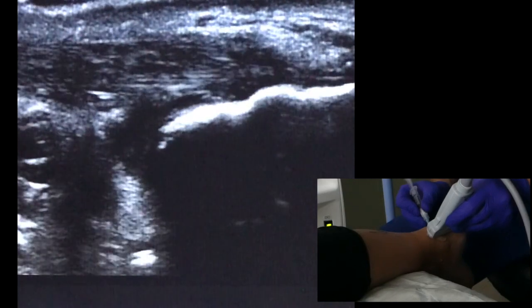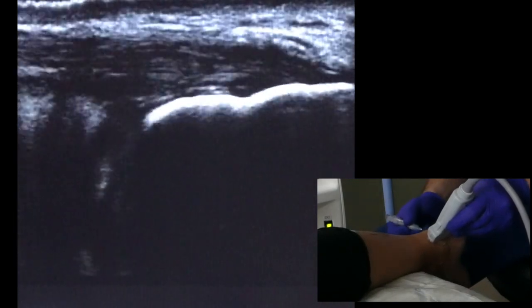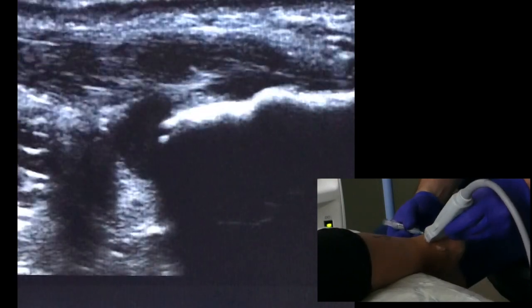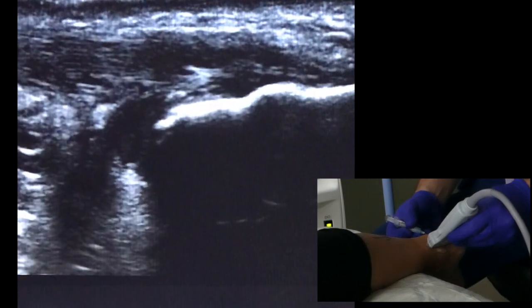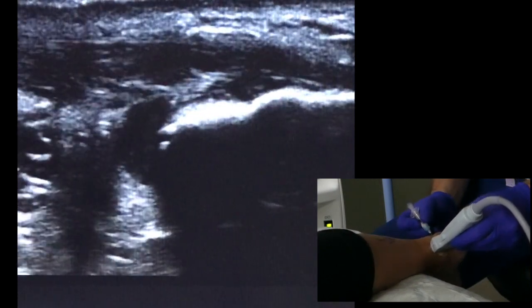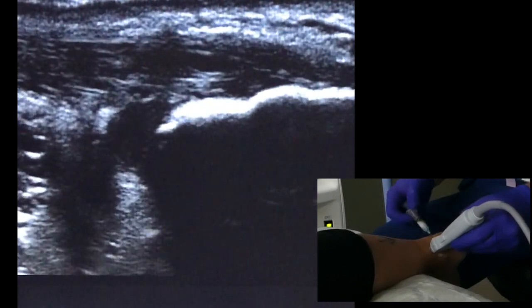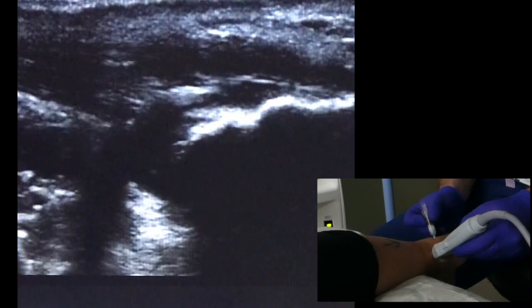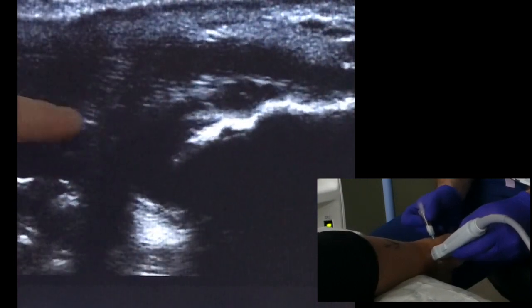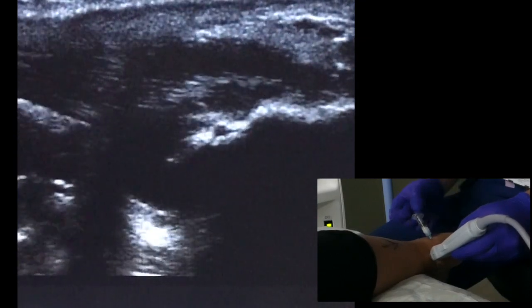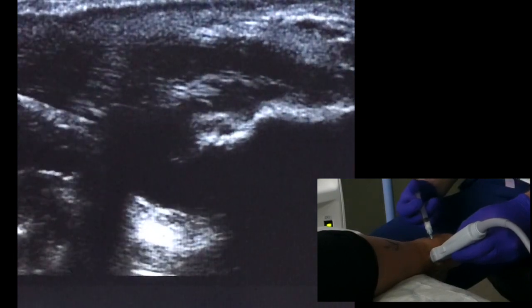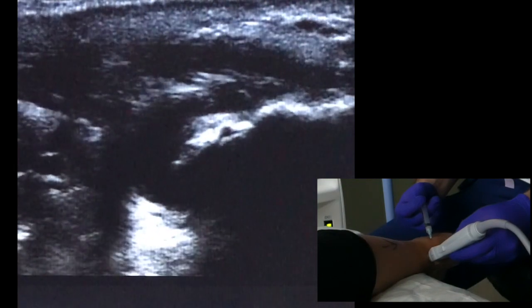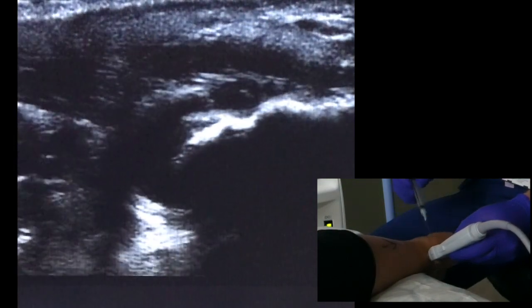Can you just see that? There's a little bit of patient feedback in the background. That's the U and the R sign. You can just see that's where the needle is. I'm moving it with my right hand so you can see the needle coming in just here — just see that moving there. There's a little bit of pressure now. And there's the bursa now, just flying over the top, and we're in. All done. You okay? Yeah. My apologies, they are a bit sore.